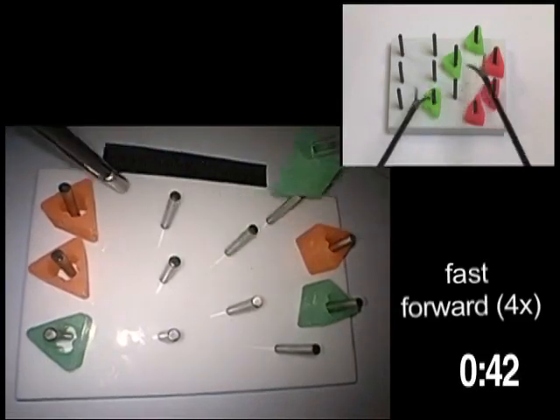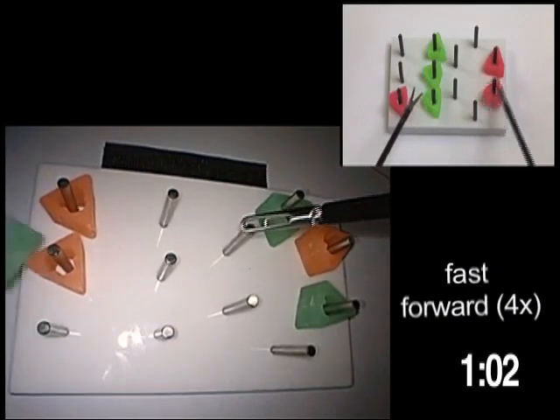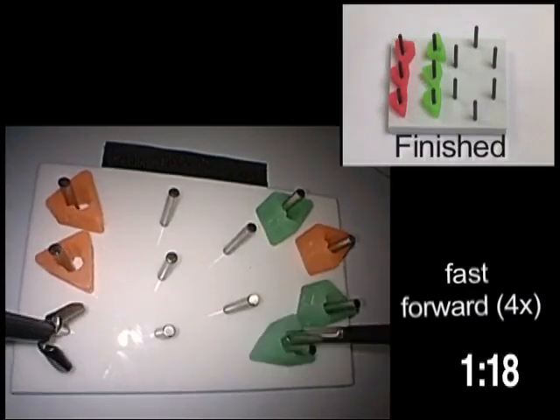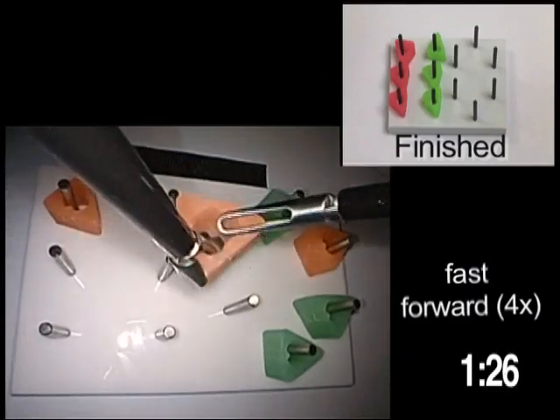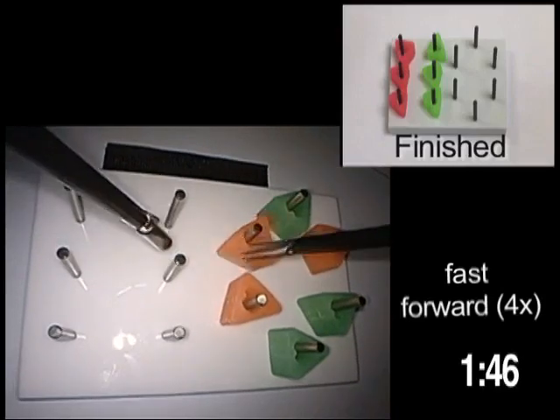When all objects are placed on one side of the board, transfer them back. This time, lift each object with your dominant hand and transfer it in mid-air to your non-dominant hand. Time stops when the last object falls over the last pin.